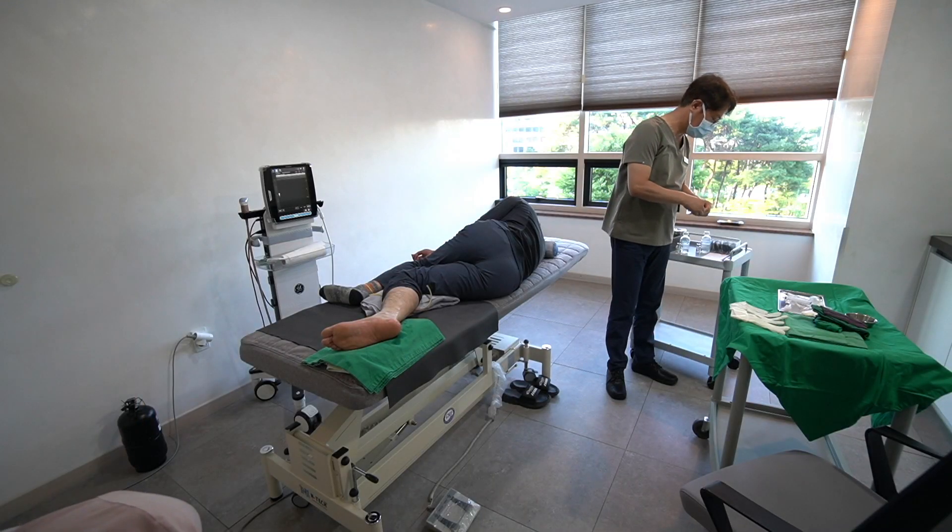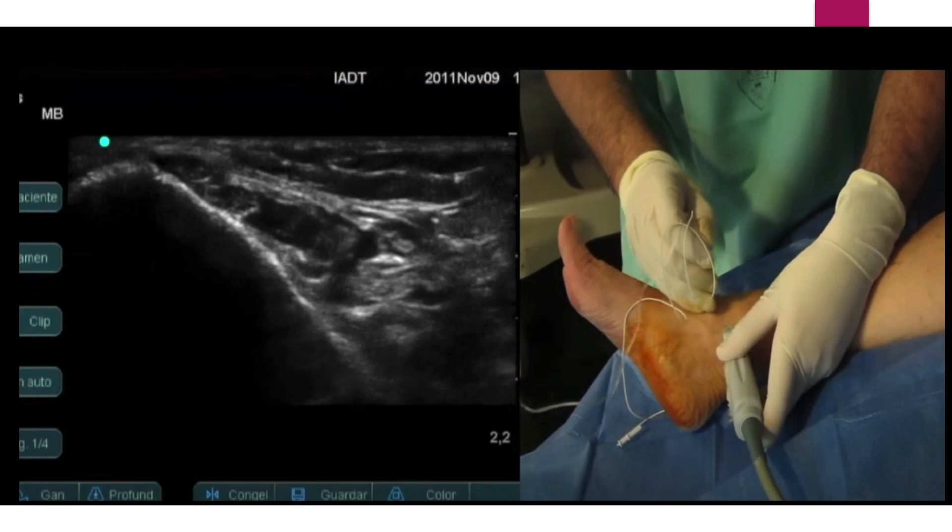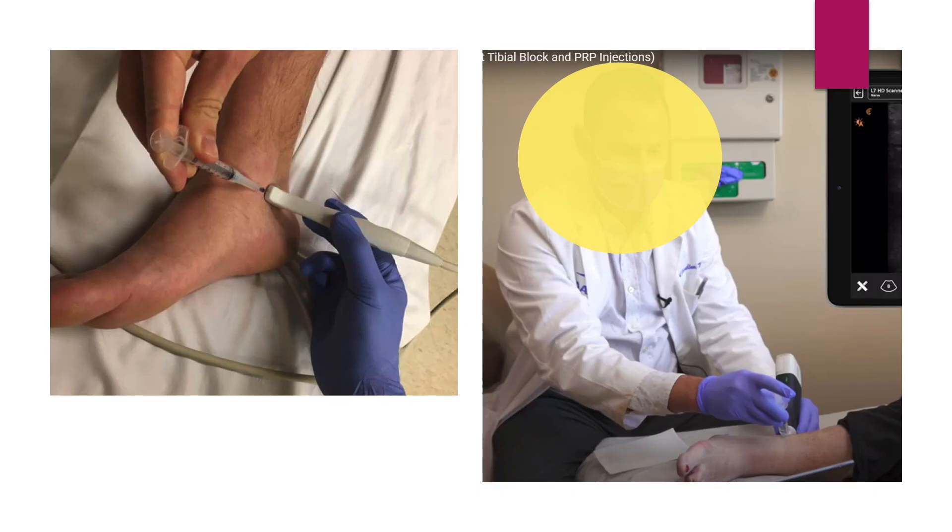Let me explain my patient's position. If you check some lectures on YouTube, you will find that many doctors prefer a patient's supine position and insert the needle from anterior to posterior direction.